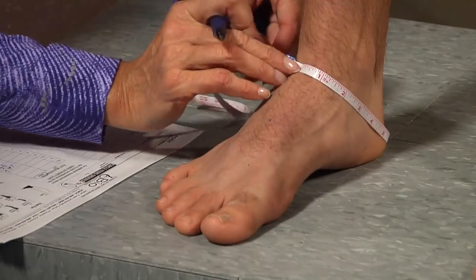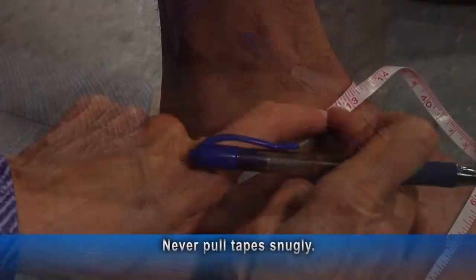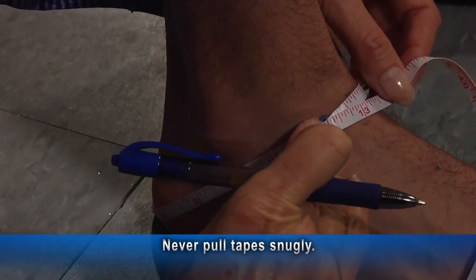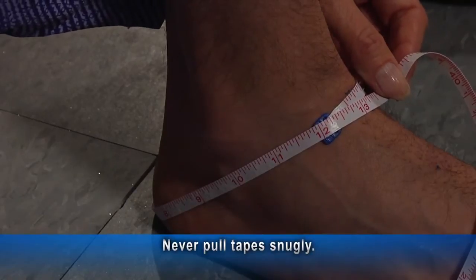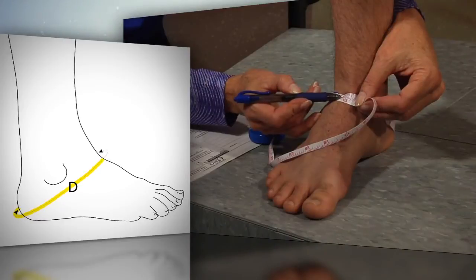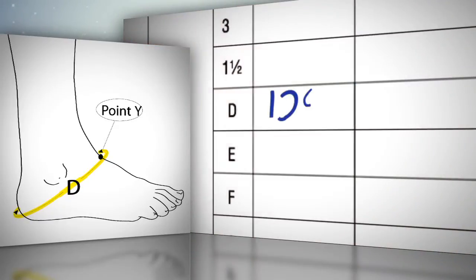Wrap the retractable tape measure around the foot from the back of the heel to the front of the ankle. Use the BioConcept's retractable tape for circumference measurements, and remember, never pull the tape snugly. Measure the circumference of the heel and make a mark on the patient at the anterior of the ankle at point Y. This is circumference capital D, which is entered into the appropriate blank on the foot measurement chart.